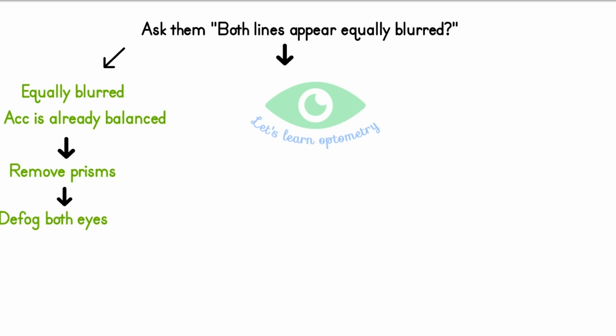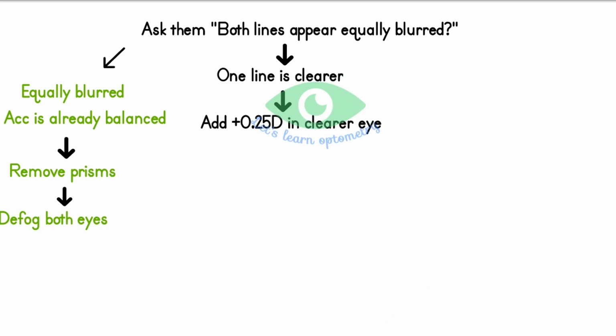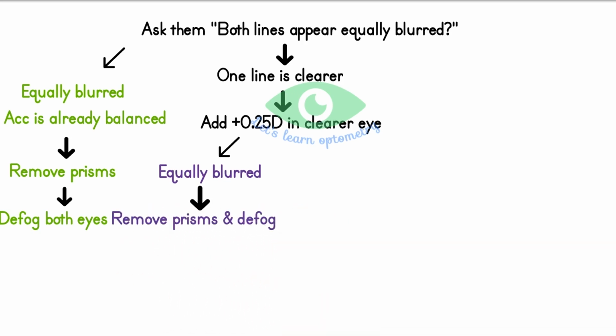If they say one line is more clear than the other, we place plus 0.25 spherical in front of the eye with a clear image. For example, let's consider patient says top image is more clear than the bottom image. The top image belongs to the right eye, so we place plus 0.25 spherical in front of right eye. Now ask whether both are equally blurred. If yes, ask them to close the eyes, remove the prisms and ask the patient to open both eyes. Defog in 0.25 steps until you achieve their initial BCVA.